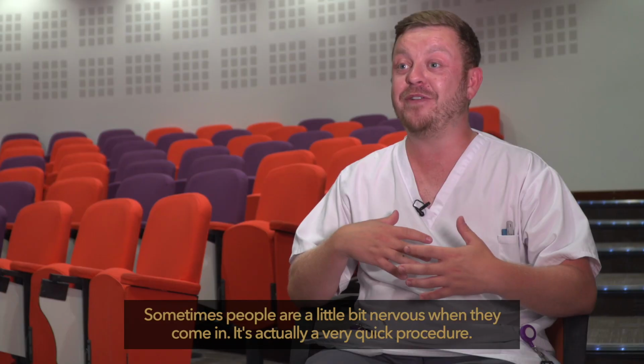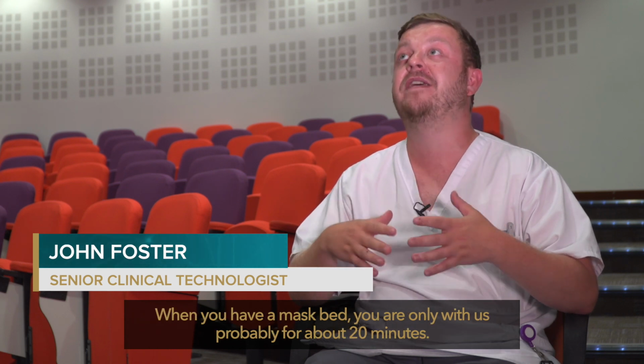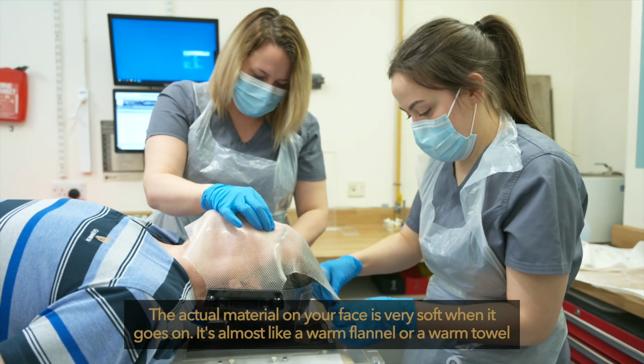Sometimes people are a little bit nervous when they come in. It's actually a very quick procedure. So when you have the mask made, you're only with us probably for about 20 minutes. The actual material on your face is very soft when it goes on.